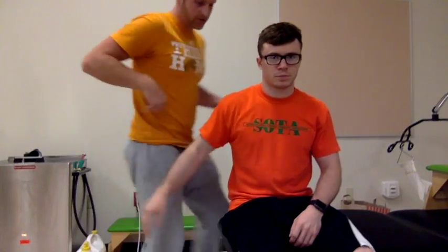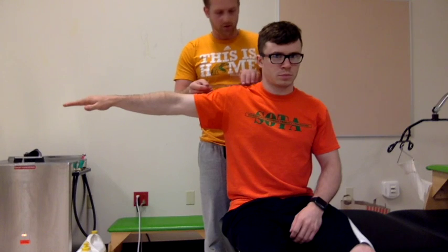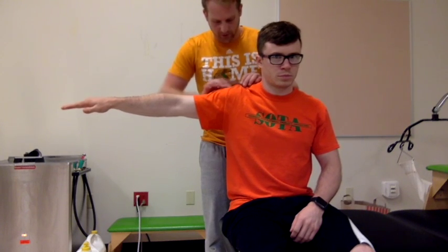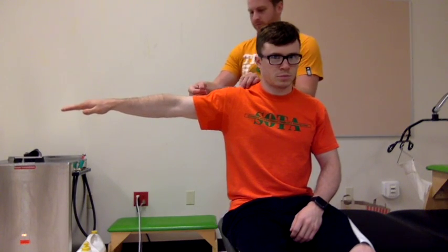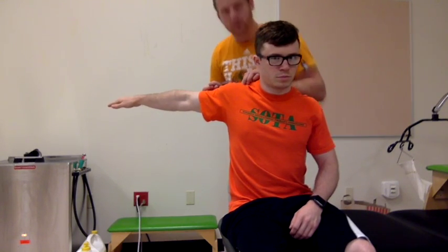This is horizontal shoulder abduction. We're going to have the stationary arm towards the neck, the acromion process as the axis. Go ahead and perform for me. And then you move this along the arm, and he has 20 degrees.